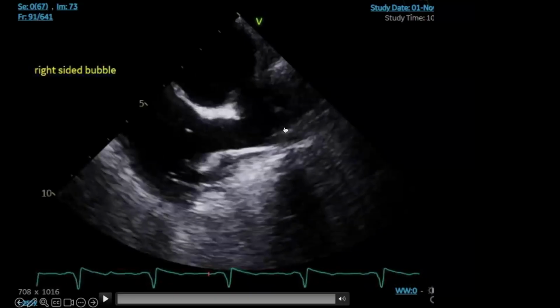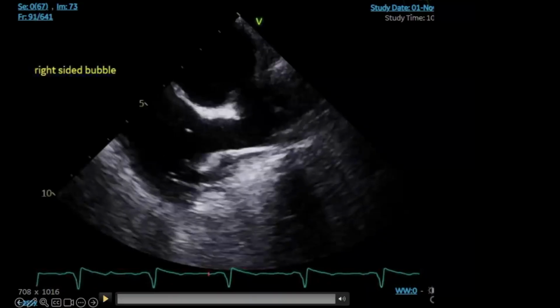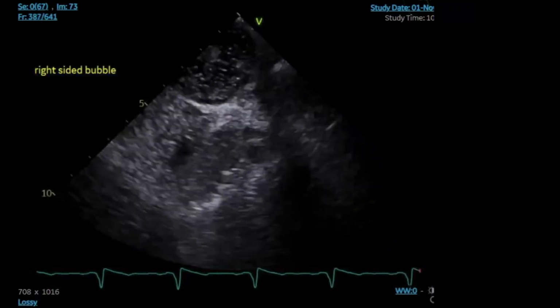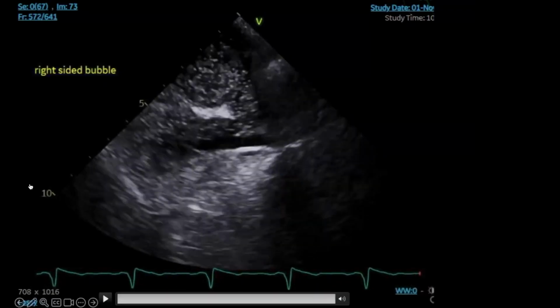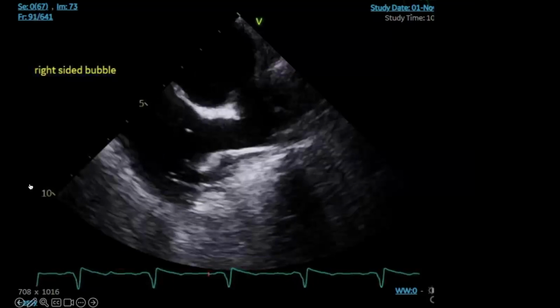And then when we injected from the right side as opposed to the left side, we saw that we were directly targeting that superior vena cava and where the sinus venosus defect was, so we could very clearly visualize the shunt. So you can see why we saw such profound bubbles on the transthoracic. Okay, 5 minutes to go, so I think I'll stop there.